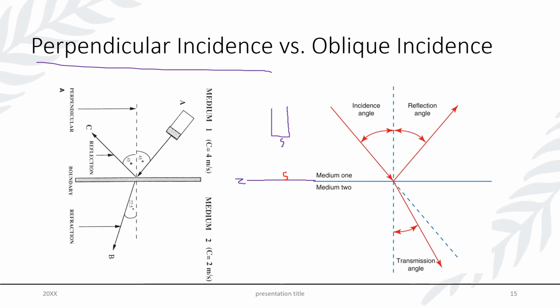If we pop back to our last image, you could see that the portal vein was not only a good demonstration of a large change in impedance, it was also a great demonstration of obtaining perpendicular incidence to enhance the strength of your returning echo. Now, that's not always going to be possible. You guys know better than anybody that organs are not arranged on vertical and transverse or longitudinal and transverse axes. And even if they are, lots of times we're having to scan around different gases and organs in order to access what we're actually looking at.